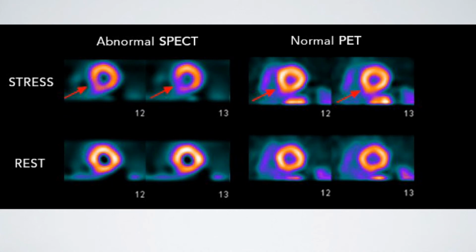And if you look, what we're looking at is a diagram that's very akin to the MRI image. That ring of light that you see is the left ventricle. So it's basically a ring of signal from the left ventricle. And if you look at the resting images at the bottom, so this is just when the patient is at rest and normal heart rate, let's look at picture 12. You see a nice round ring, a nice round donut.